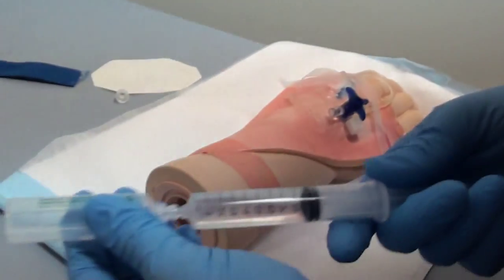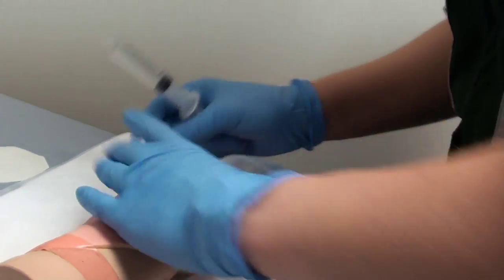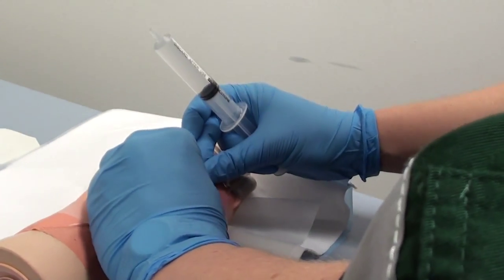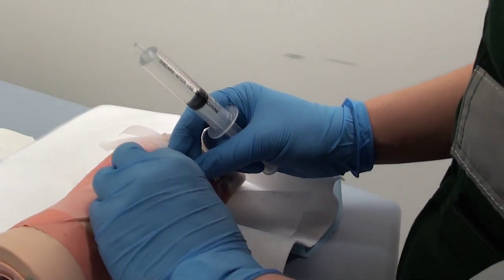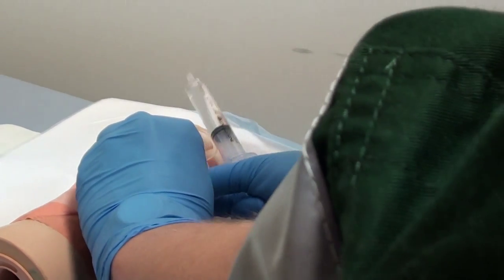So now, just to double check the patency, I'm going to flush this through.